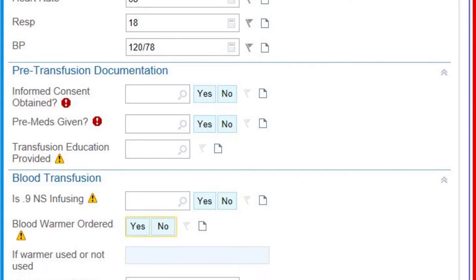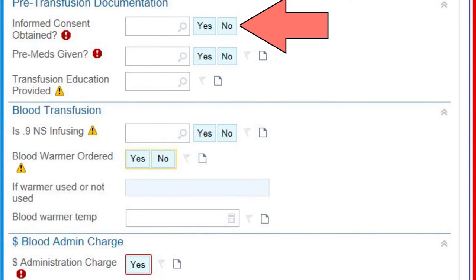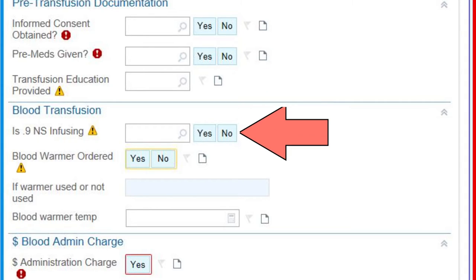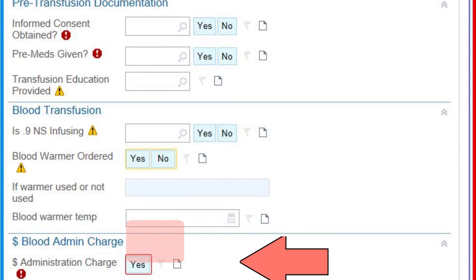Scroll down to address some more required fields. Verify that consent was signed, that any pre-medications were administered if ordered, that patient education was provided, and that normal saline is infusing. Remember, 0.9% normal saline is the only solution that is appropriate for use with a blood transfusion. Identify if a blood warmer was used, and finally choose Yes on administration charges to complete this sheet.